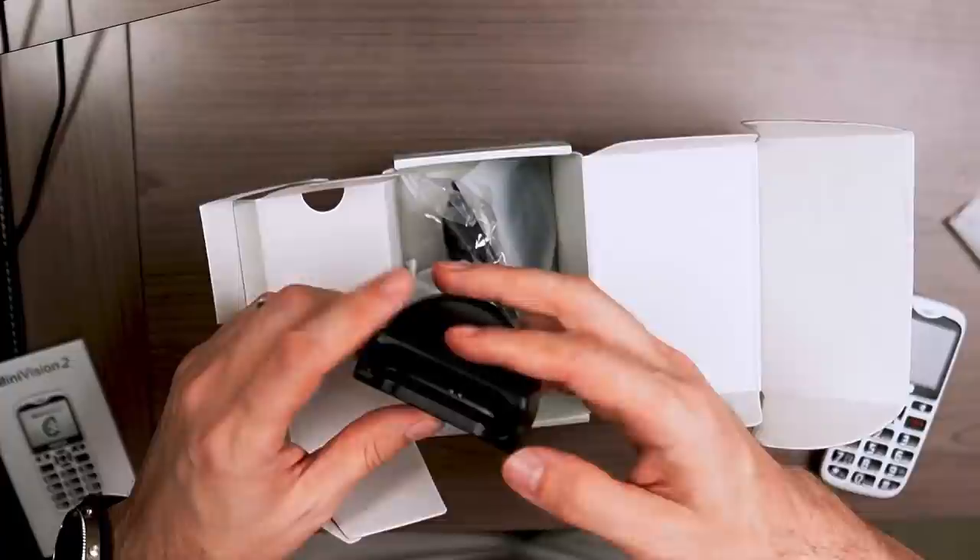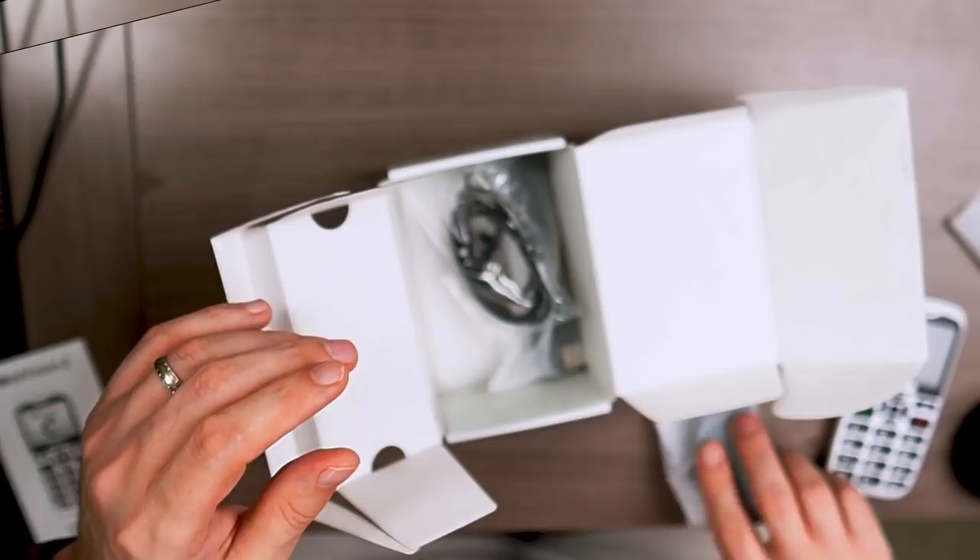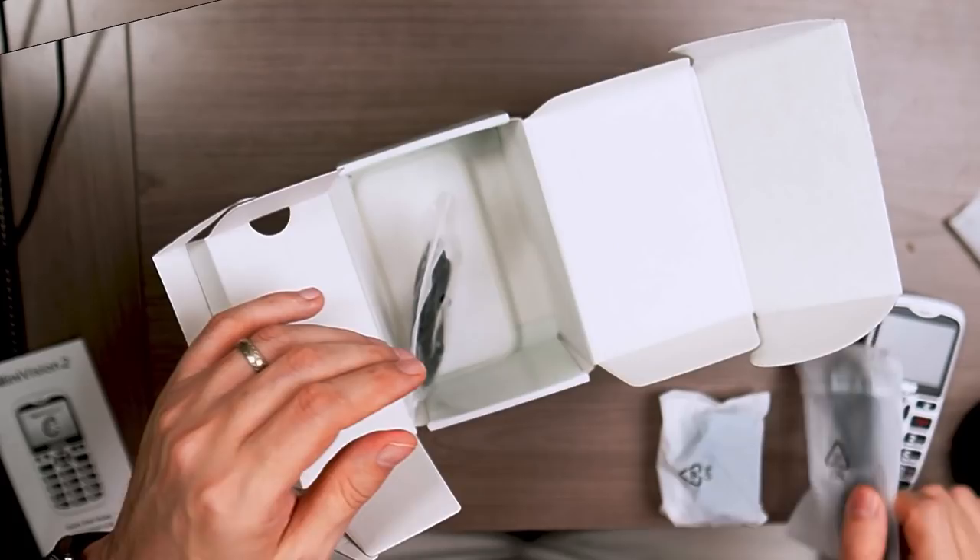You have the charging cradle, which allows you to do essentially wireless charging. You have your charging plug — the wall outlet brick — and your charging cable, which is a micro-USB cable inside a bag.